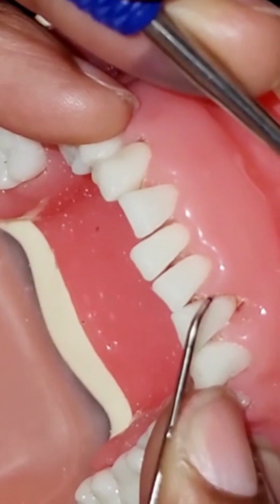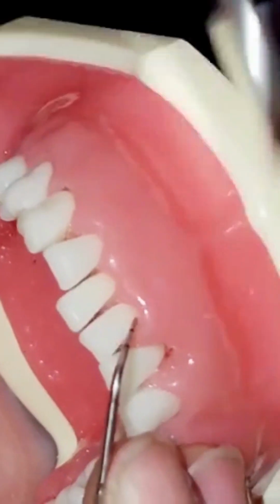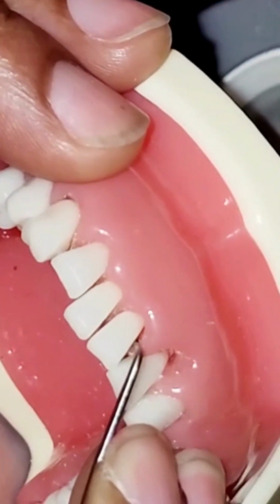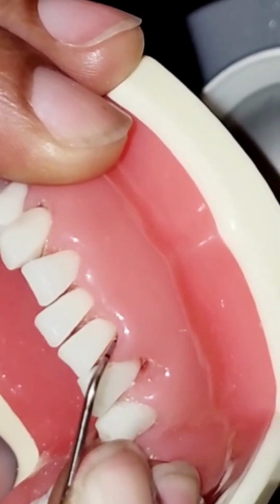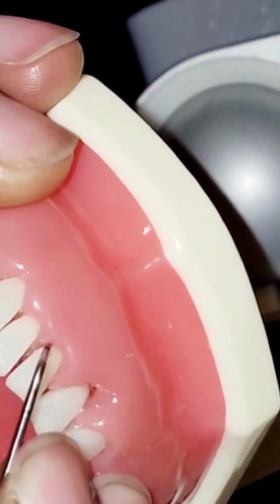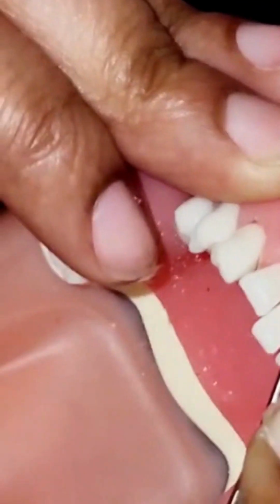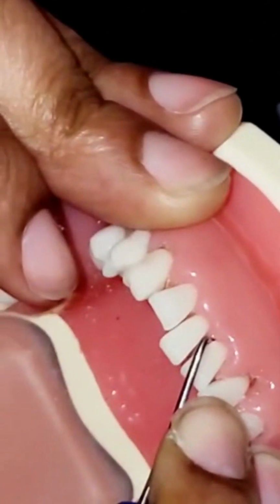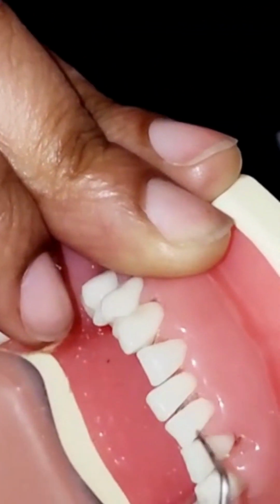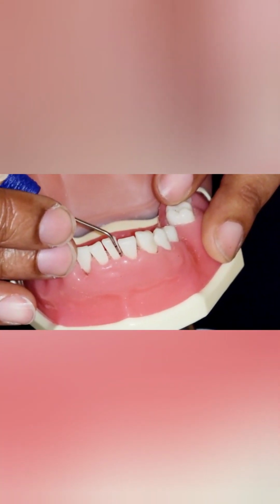Eight. 9. 11. 8 followed by another 11. Ooh, some deep pockets. Now that we're entering a new quadrant, our distal angle will begin here.